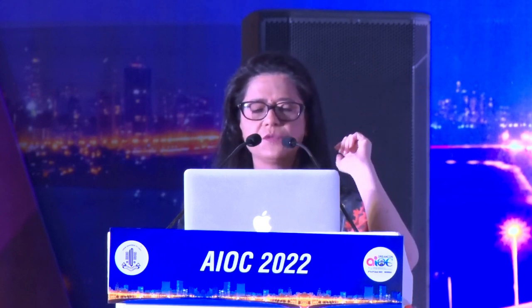So, how to choose the lens: when you go back to your OPDs, please make a questionnaire format. There are some standard ones out there. Even the company people give you one. The patient sitting in your OPD while he is getting worked up can fill those forms as to what his visual requirements are. I'm not going to go into detail here because after the end of the instruction course, we will discuss the patient's requirement. For example, if somebody's near work is more, or if distance is more, we will decide on different clinical situations and help you choose a lens.